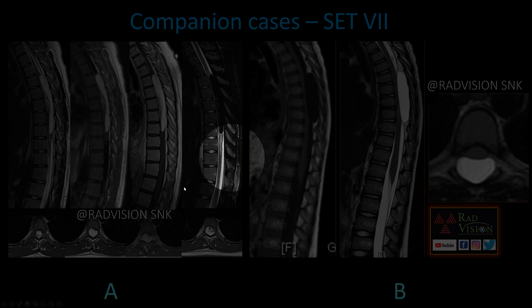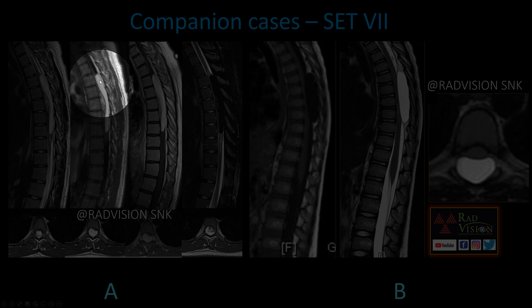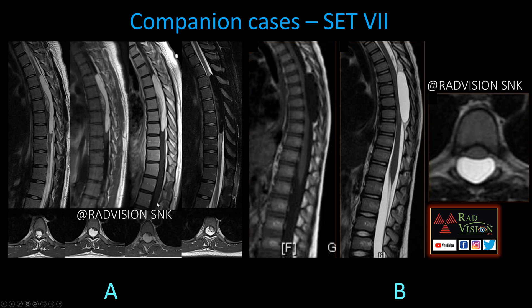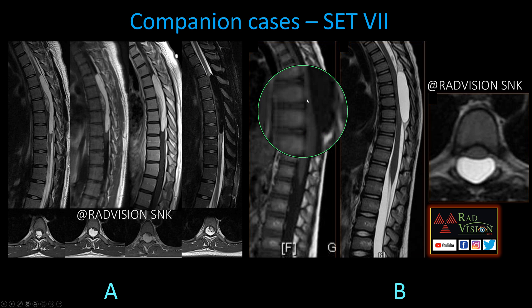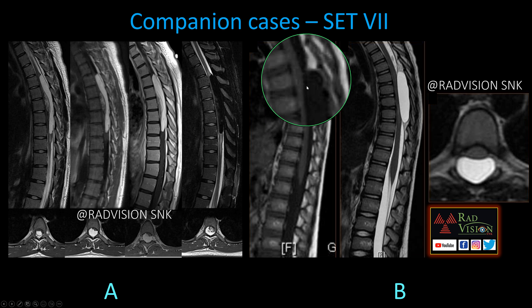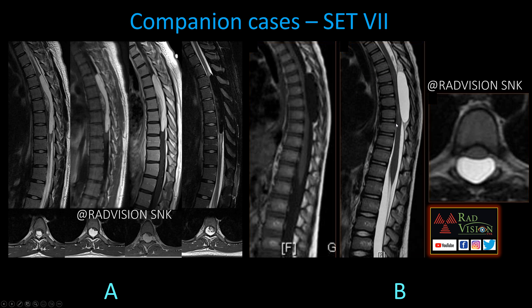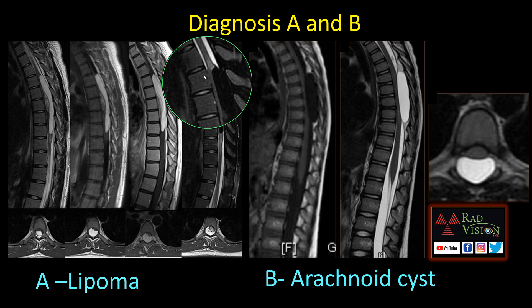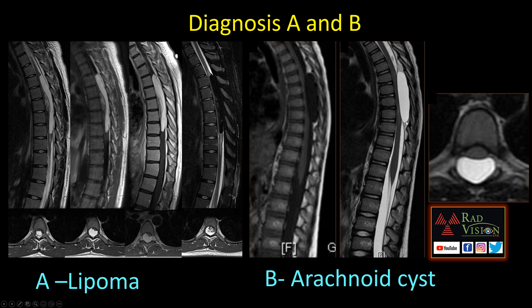Next case shows a cystic lesion in the intradural extramedullary location, hyperintense on T2, hyperintense on T1, and completely suppressed on fat-suppression sequences, causing displacement of the spinal cord to the left — this is a spinal lipoma. The second case shows a cystic lesion in the extradural location causing displacement of the spinal cord, hyperintense on T2 but not suppressed on fat-suppression sequences — this is an arachnoid cyst.